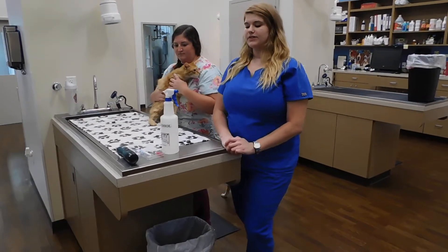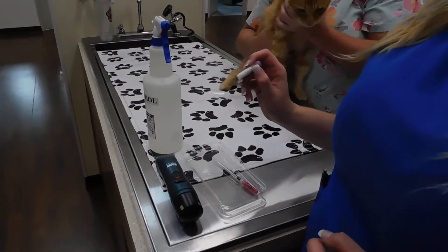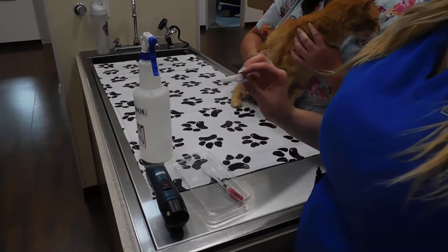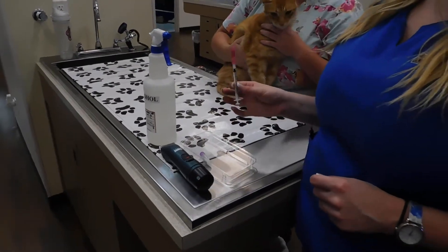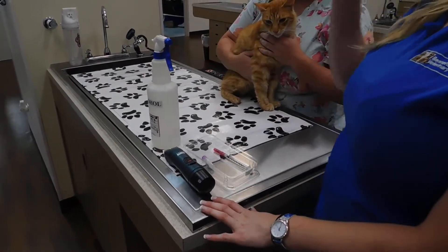This is TAS19. We're going to be doing cephalic venipuncture on a feline. We've got our tray of supplies here. We have an EDTA tube — we don't have any vacutainers for the sample we need to submit today, so we will just be using this EDTA tube. We have a 1cc syringe with a 25-gauge needle, clippers just in case we need to clip the site, and alcohol to prep the site.